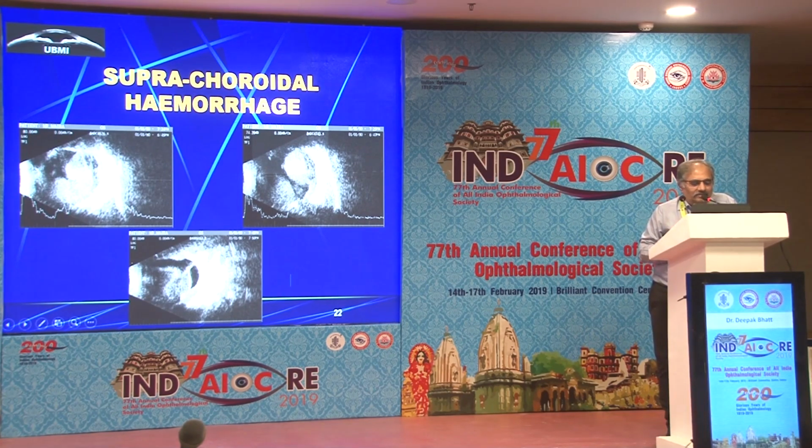And after 6 months, he came back and he said, oh, I'm feeling fine. And he came to me for a repeat ultrasound. This is our ultrasound after 6 months. If you see here, the same lobulated lesion we have started seeing at the periphery, and the optic nerve has now started to be very clear.